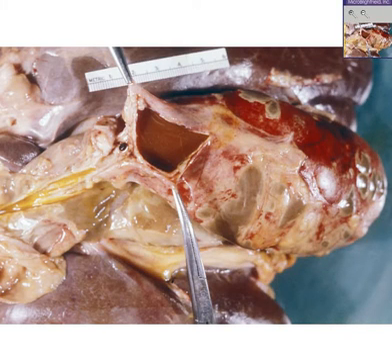Okay, I hope this can be a fairly straightforward case. Here is a picture of a gallbladder, possibly in surgery, in which you could see the wall is starting to be opened, and you could see that the external surface is not only very red and hemorrhagic, but is slightly yellowish, like there might be exudate or fibrin or pus on the surface.